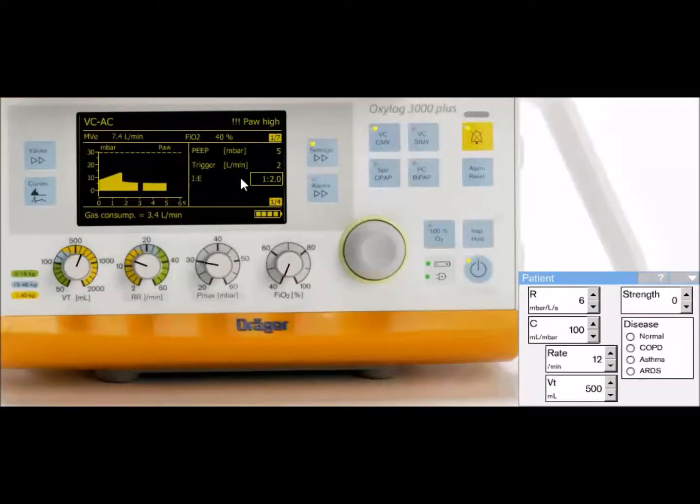Now, one could argue that by having this pressure limiting, that provides lung protection, and it does. So if my patient's compliance changes, it limits the pressure, and it's still giving the breath so I don't have very low tidal volumes. However, there's no automation in this at all. This is still operator input. They have to turn this up and down and set it appropriately. So there is no automatic adjustment.